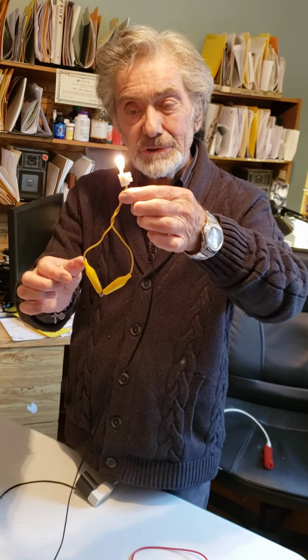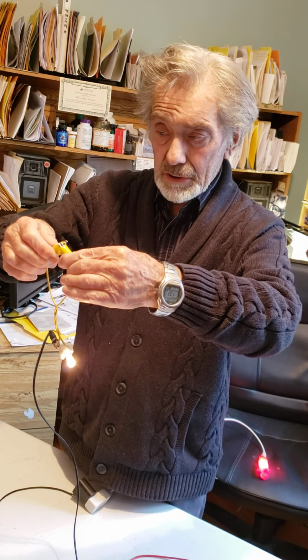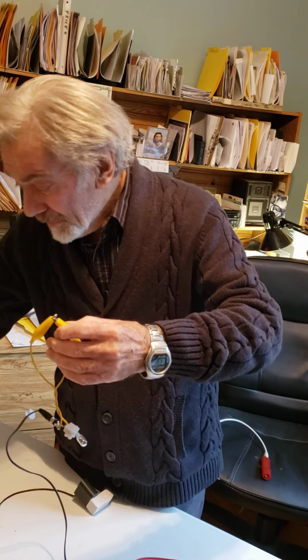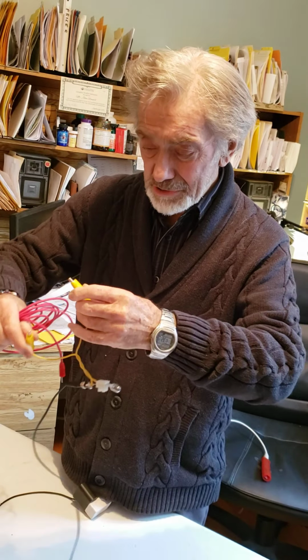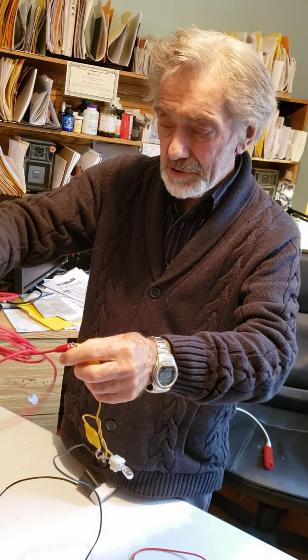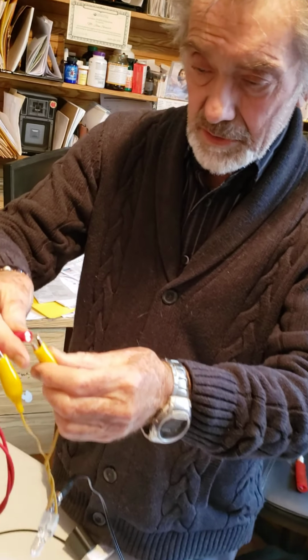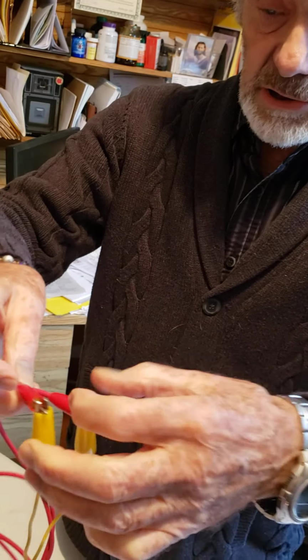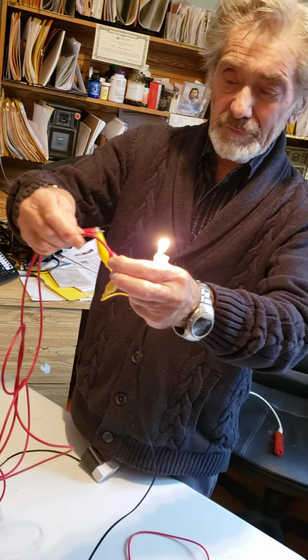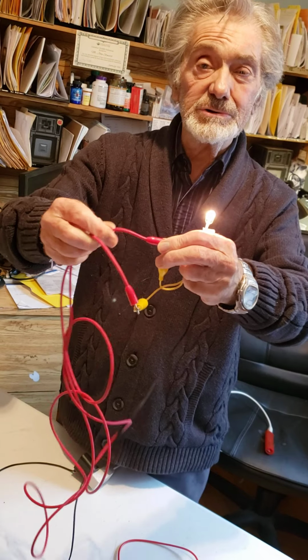Now, you can use this little device here. Those two clips allow you to check. I'll show you what I can check. I can check therapy cables to put current into patients, like here. I want to check the integrity from here to here of this red cable, and jiggle. It's difficult because this is faulty now, but if I jiggle this, there's no problem. Jiggle this, there's no problem.